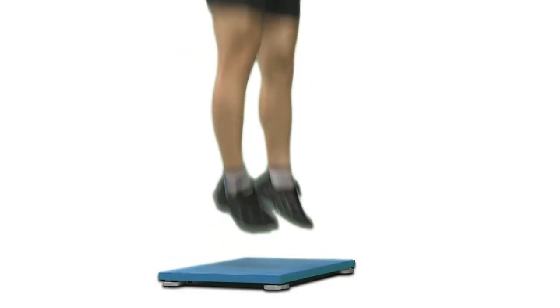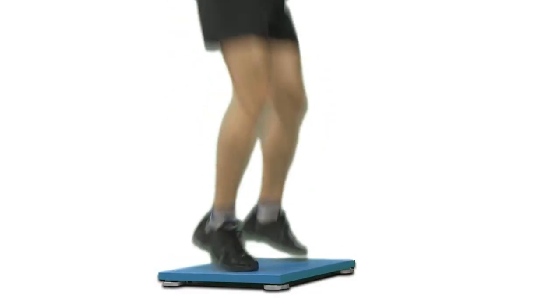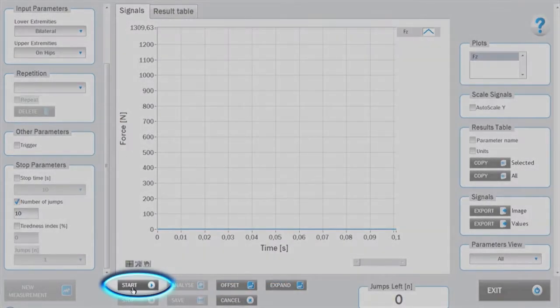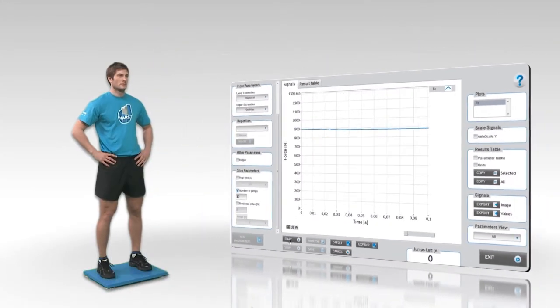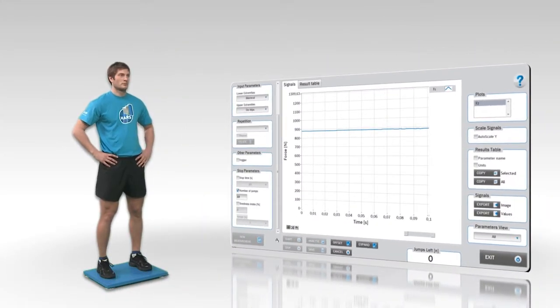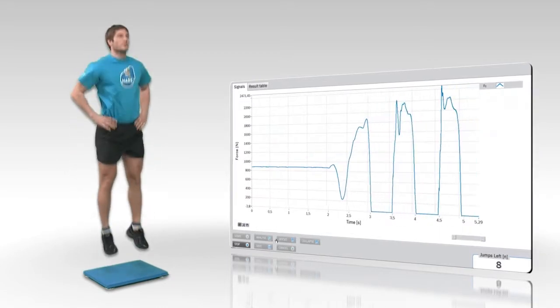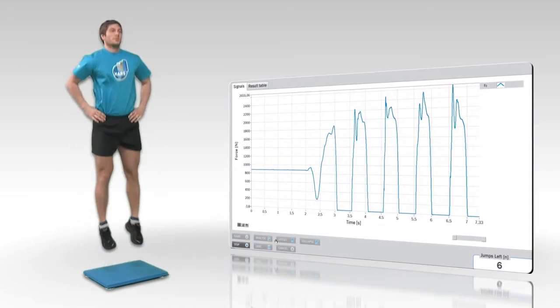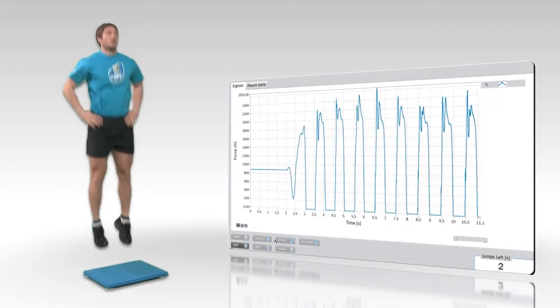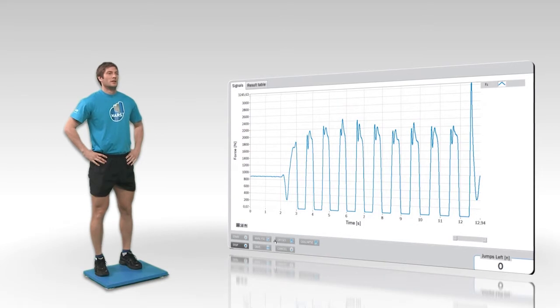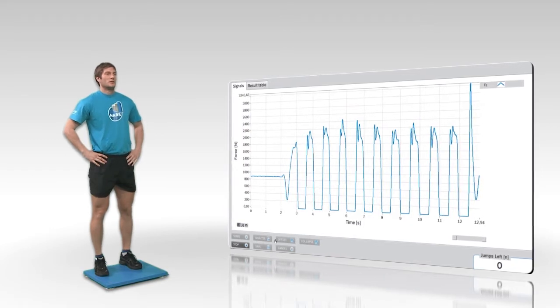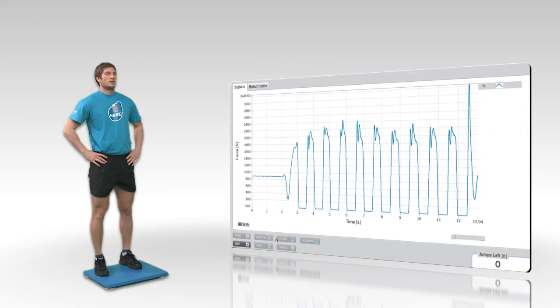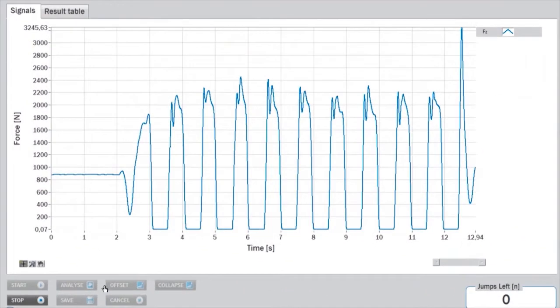Initiate the measurement by pressing the start button. The subject should strive to perform all movements as quickly as possible without stopping during the task, meaning the highest possible jump in the shortest possible time. During all landings, the subject has to make first contact with extended legs and feet in plantar flexion, followed by the required active counter movement.